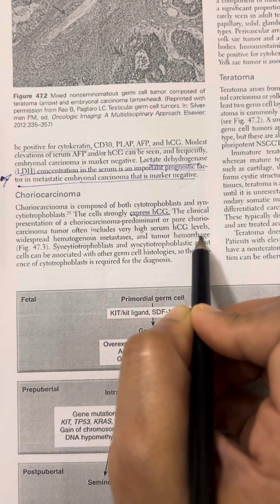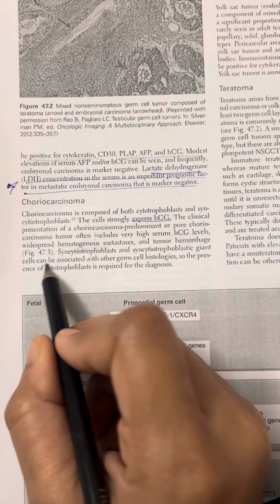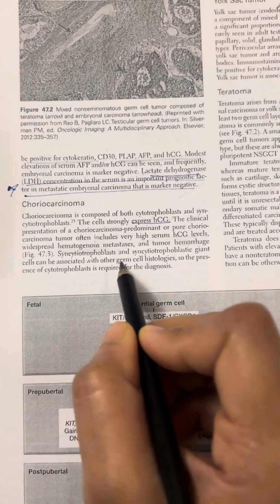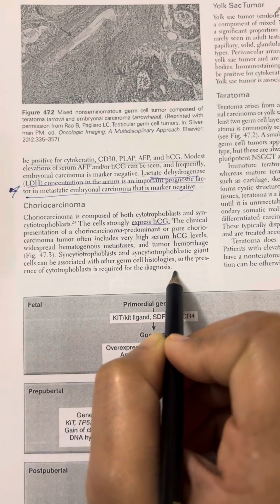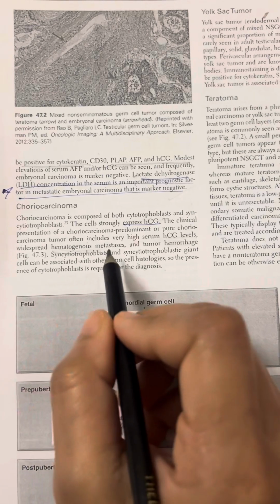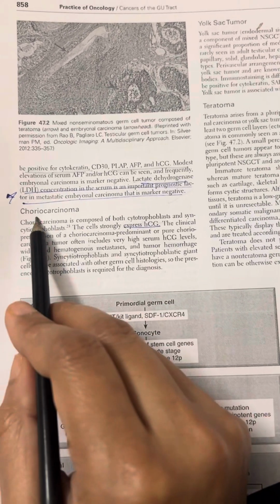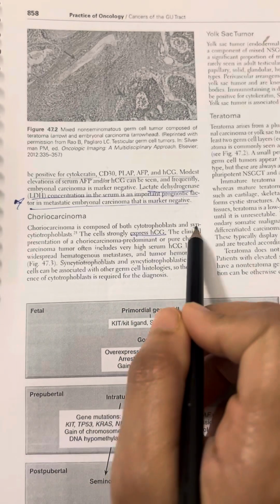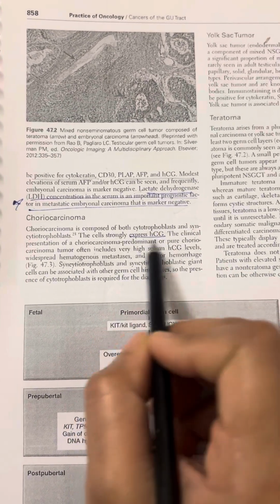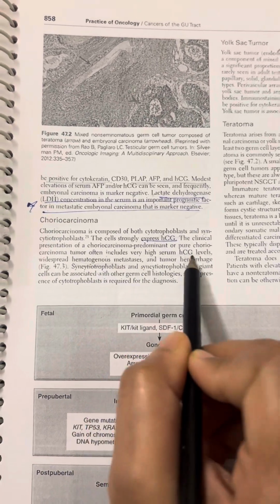Syncytiotrophoblast and syncytiotrophoblastic giant cells can be associated with other germ cell histologies, so the presence of cytotrophoblast is required for the diagnosis. So for choriocarcinoma, both cytotrophoblast and syncytiotrophoblast with expression of HCG, and there is widespread hematogenous mets and tumor hemorrhage.